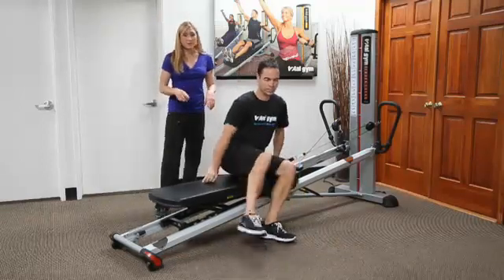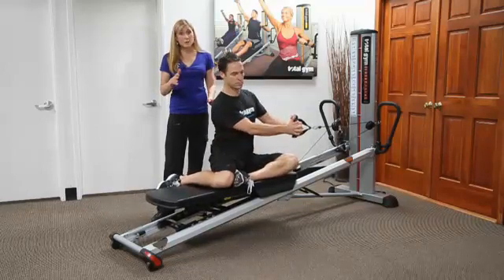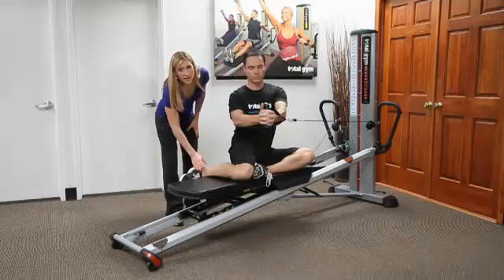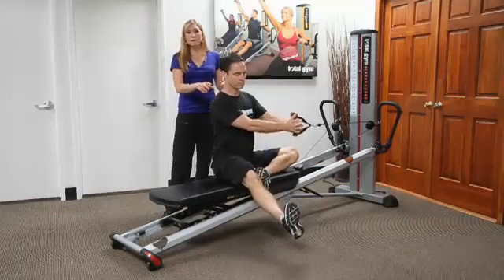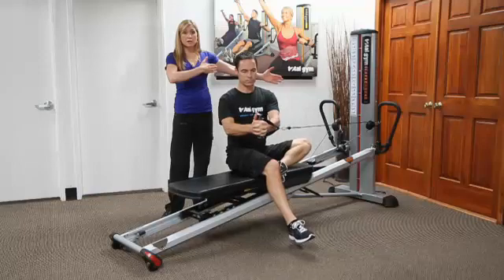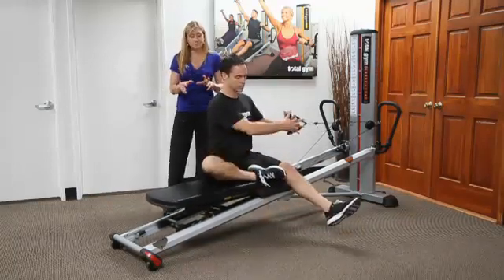So mermaid would be one leg can be back, the other leg's crossed in front. It takes a lot of hip mobility and not often something that we see with people. So this leg can come out, and then he can have a little bit of a figure four. It doesn't have to be positioned like this. You can do it the other way, where the leg closest to the base is bent and the other leg is straight, whatever feels or looks the best for your client.